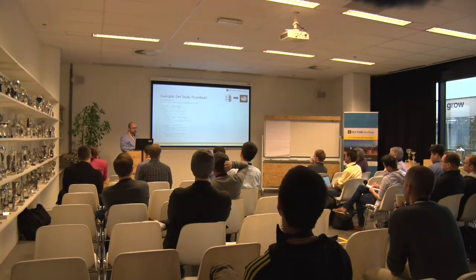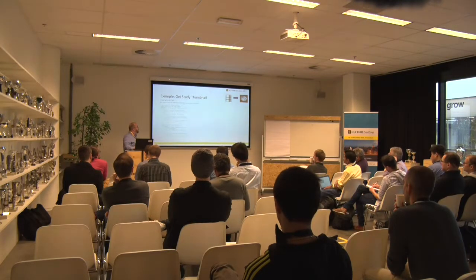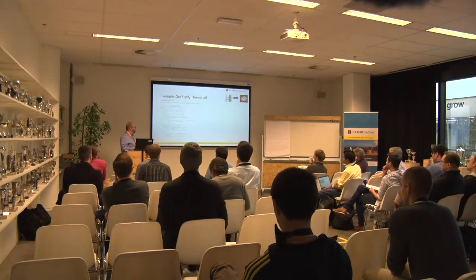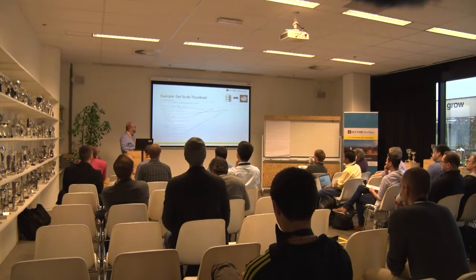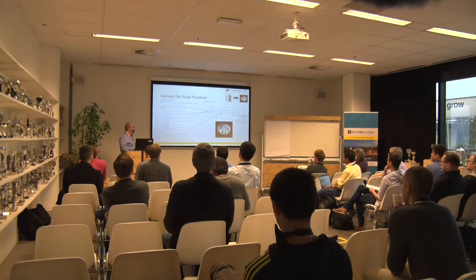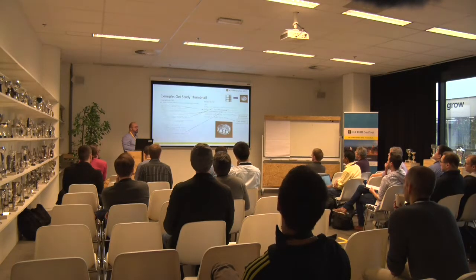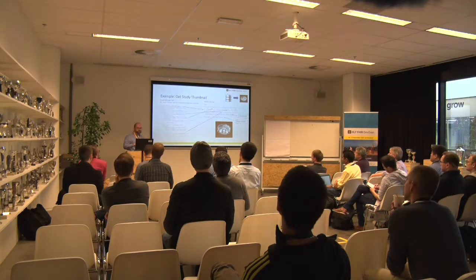So looking at, we put it all together. This example that I created, I showed actually last year, is a get study thumbnail. So again, here is our imaging study resource from FHIR. We pull those things out, we can construct a WADO RS call. I added a couple of extra parameters, so viewport equals 50,50. What that allows me to do is say I want the image very small for a thumbnail, 50 pixels by 50 pixels, and I'd like it as a JPEG, and I get back an object, and I can then put in my EMR and actually show, here's the image that represents the study.